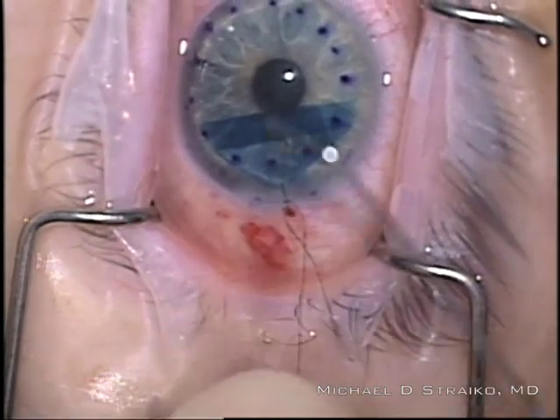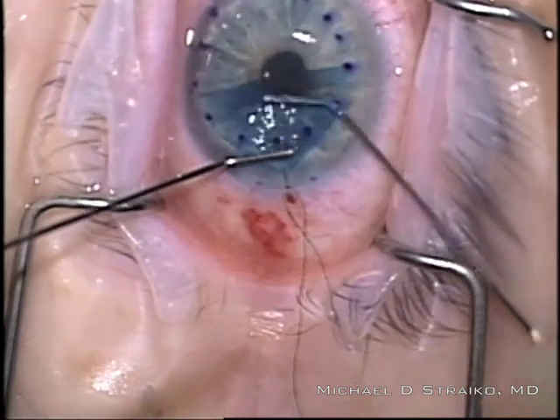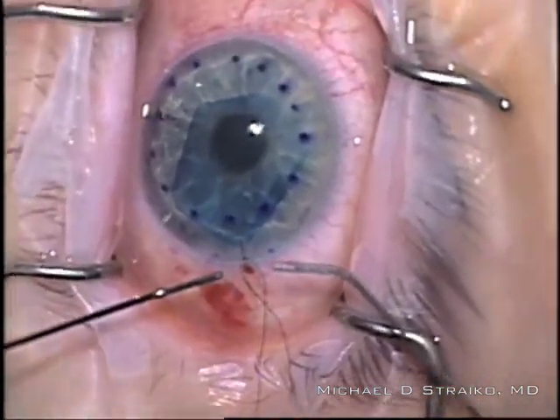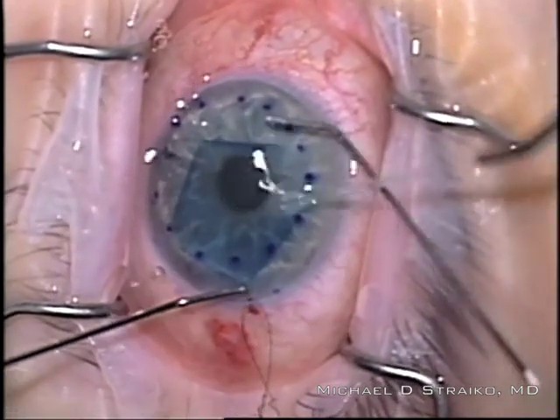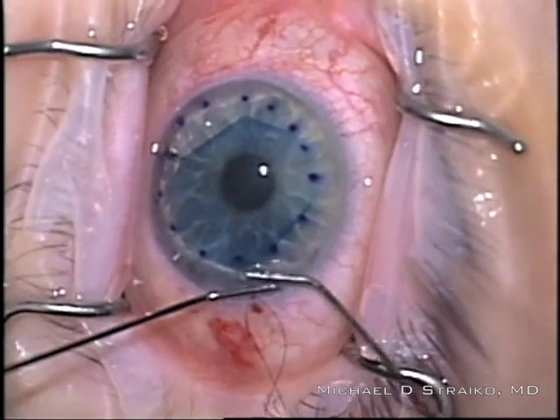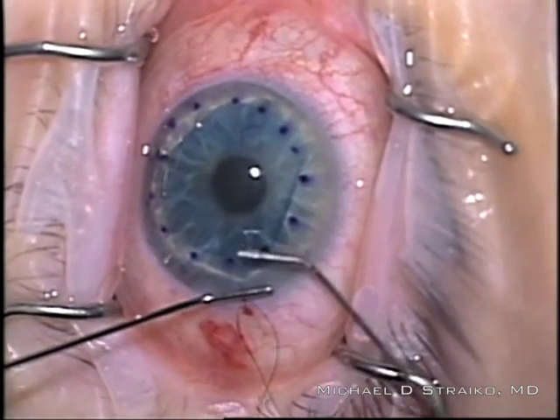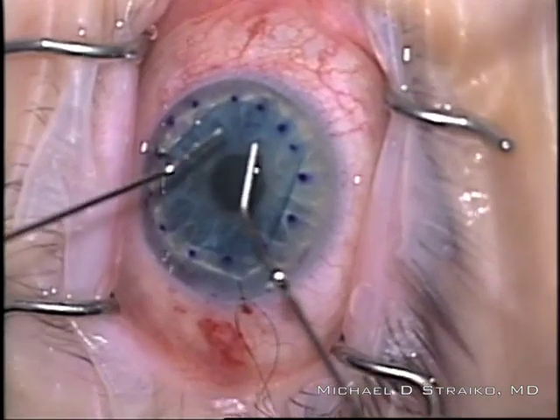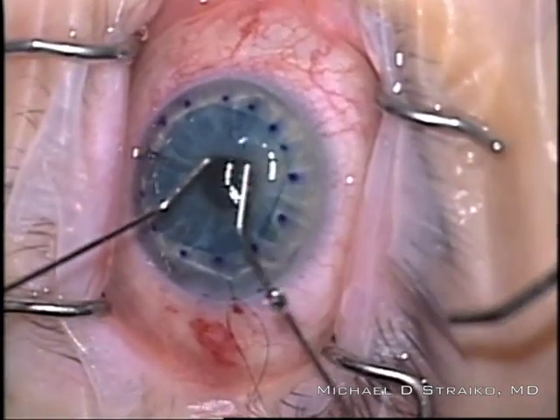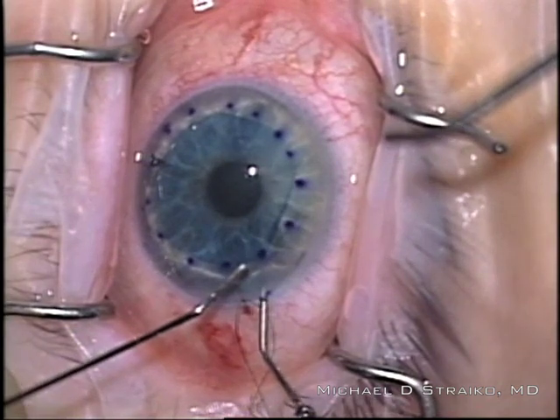This diagram shows what I'm doing: I'm pushing down on the blue arrow — not pinning or smashing the graft — but shallowing the anterior chamber to use the iris as a third hand to hold the graft, and then tapping where the orange arrow is to help unroll the graft in the direction of the deeper anterior chamber. Here I'm pushing down with my left hand and tapping with the right to unroll towards the deeper section. Now we have an S-stamp confirming correct orientation, and the graft edges are scrolling towards the cornea, with the endothelium on the outside of the scrolls. I gently bump near the edge of the graft to shimmy it into position with a couple small taps to open the edges. You can see that nice S-stamp at 12 o'clock confirming graft orientation.